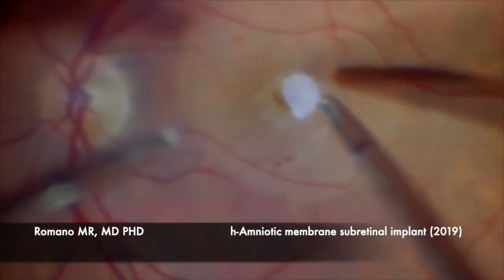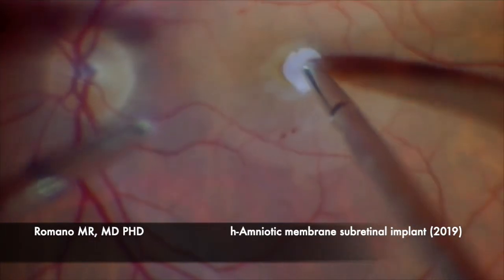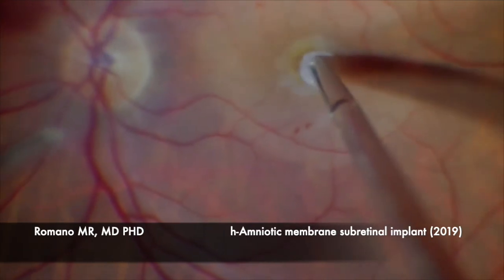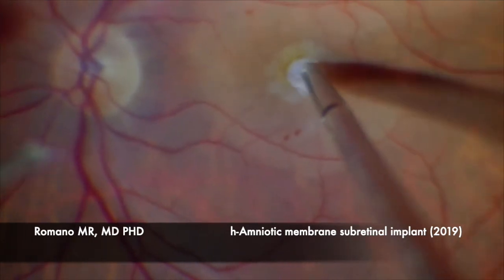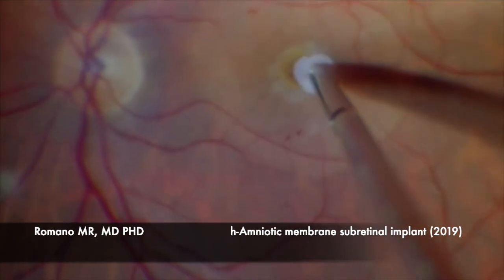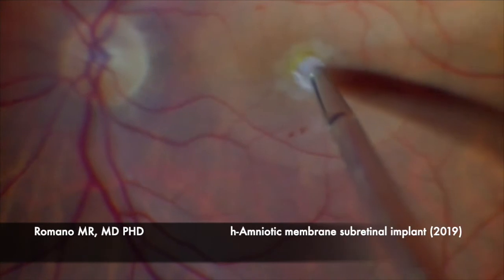Now, as you can see, the stromal layer is adhesive just on the retina, and now we are trying to fit it under the edges that were previously detached from the RPE. As you can see, it's going well.